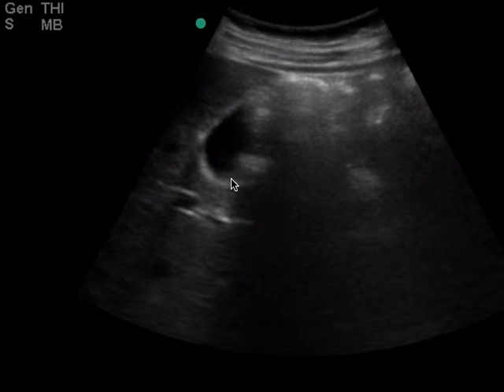One of the reasons why you see this is for two reasons. One, when you go through the medium here at the gallbladder, you have what's called posterior acoustic enhancement, which is why this looks so bright right here when the ultrasound beams travel through here. My guess is that this is bowel gas right here, and that the ultrasound doesn't travel as cleanly through the gas, through air. Sound doesn't like to travel through air.